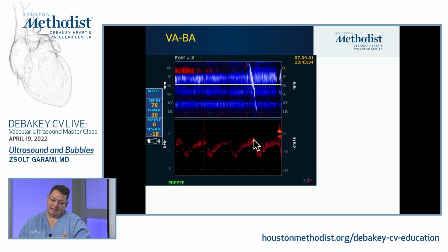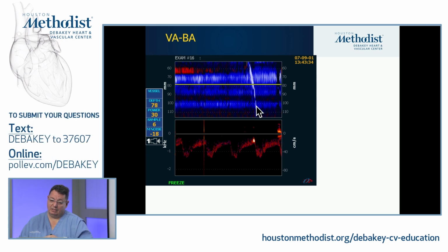Because it's at the end of the diastole. When it jumps to the basilar, look, the slope becomes a little sharp, which means that maybe it jumped over to the systole, and this is why it's traveling faster. So a slow slope, if you want to ski here, that is easier. And this is like a straight shot throughout the basilar, similar 2 centimeter distance, 2 centimeter distance, definitely different speed.